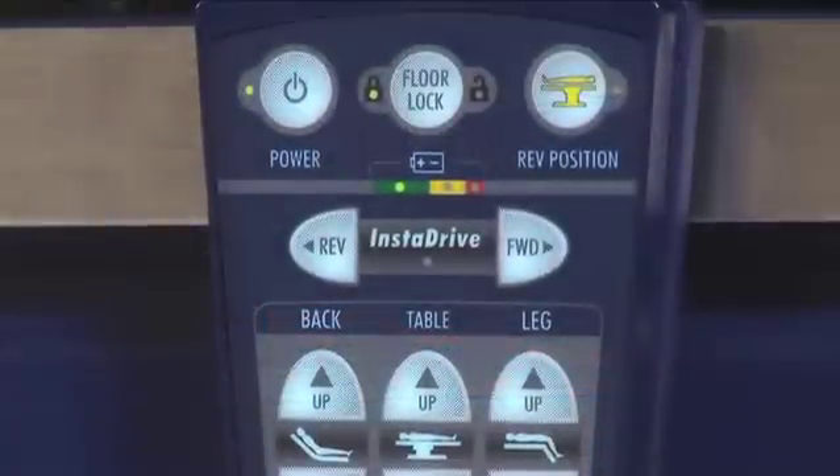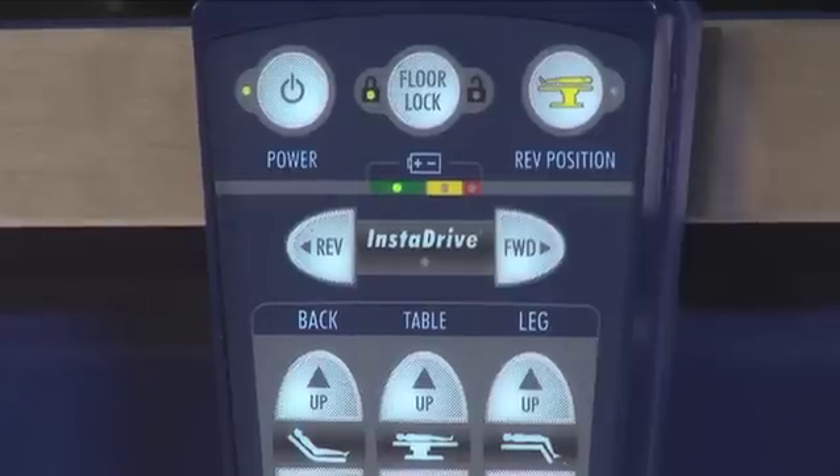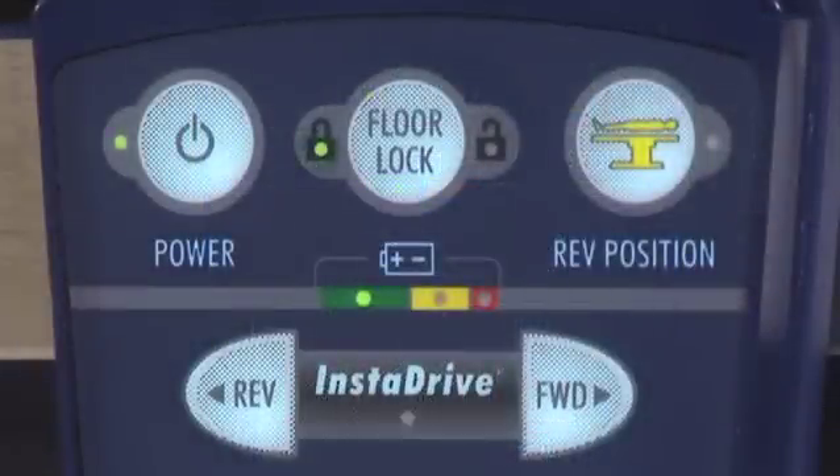Pressing any button on the hand pendant when the table is unlocked will automatically lock the table to ensure patient and caregiver safety. A green light will appear when the table is in locked mode, indicating it is safe to articulate the table.